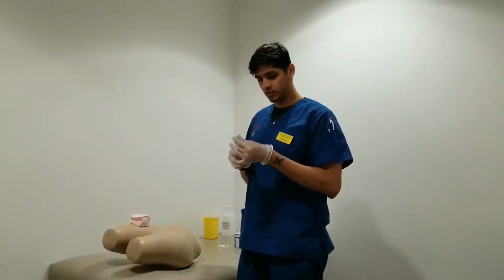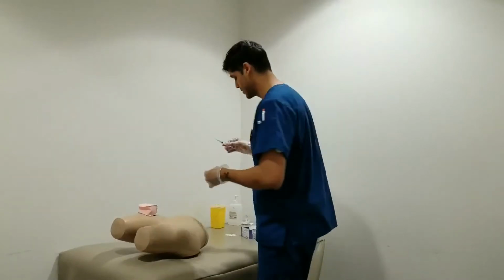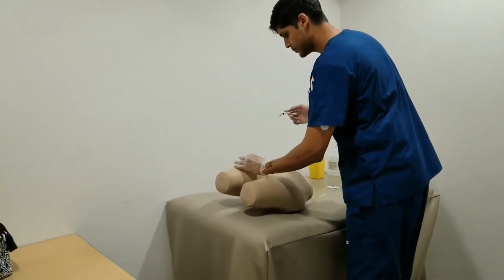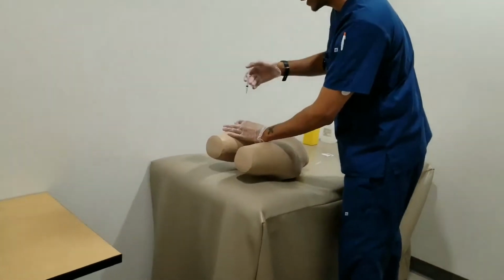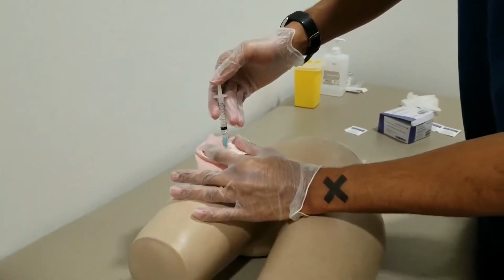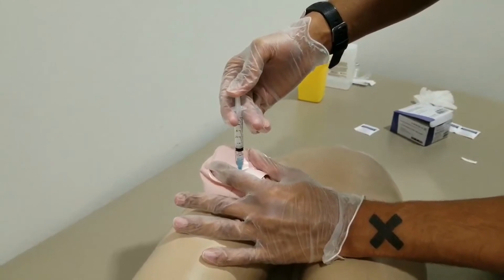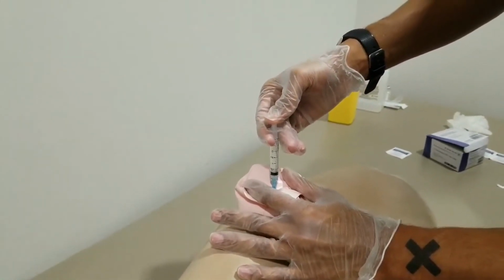I'm going to remove the sheath, pulling away from my body. I'm going to use a Z pattern with one hand or 2 fingers, and at a 90-degree angle, I'm going to go swiftly and quickly right into the muscle. Once again, just like the subcutaneous, I want to administer medication nice and slowly to prevent any pain or discomfort.